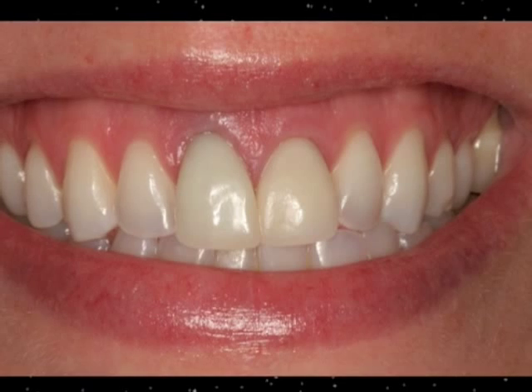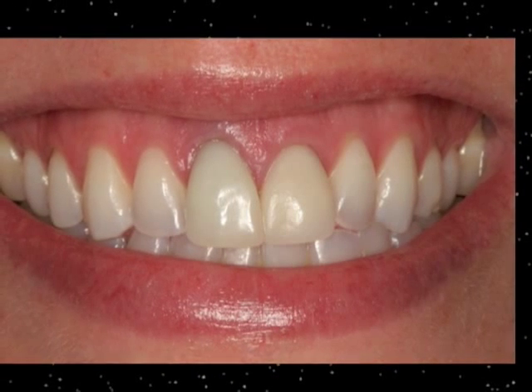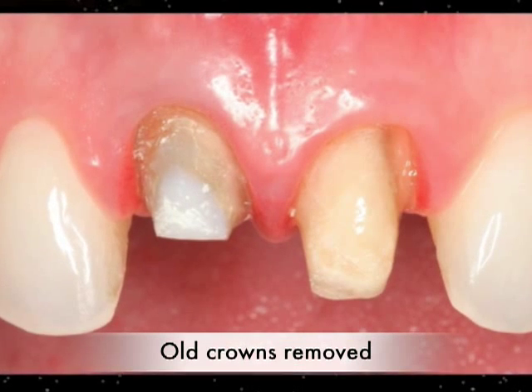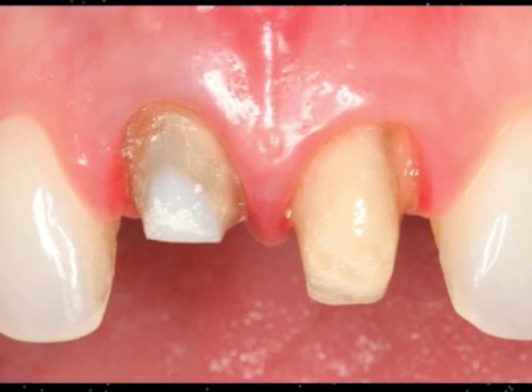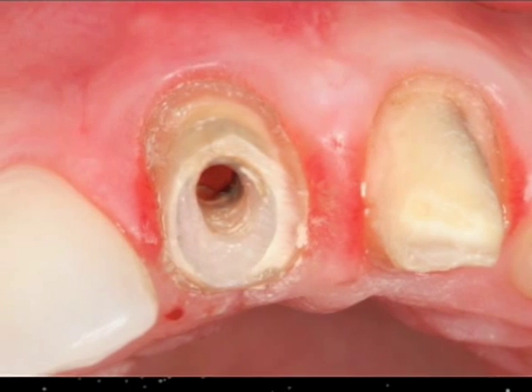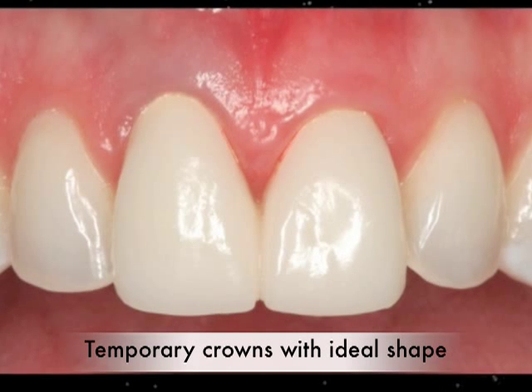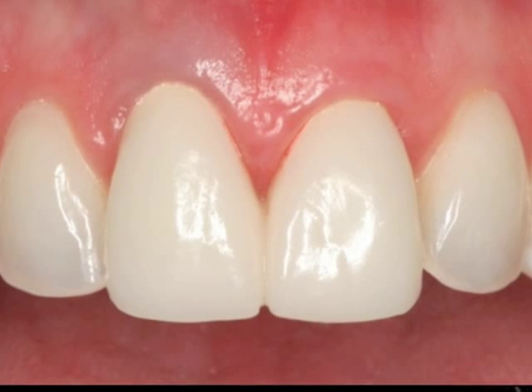So to describe the course of treatment and the steps that we took, very briefly, I'd like to show you these slides that just demonstrate the steps that we took. In this slide here, you see that we removed her old, previously placed crowns of 20 years and reprepped the teeth and created an environment for the teeth for eventually extraction of the bad root canal tooth. But instead of extracting the tooth, we put on two nice temporaries on the two teeth. And these temporaries are what we're going to use during the healing phase of the bone and implant surgery.